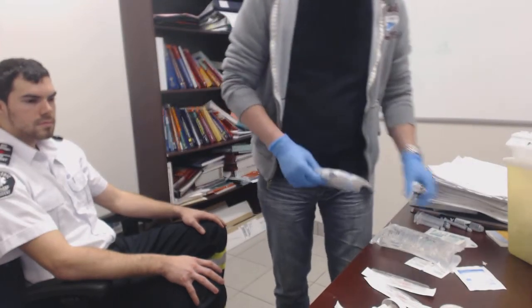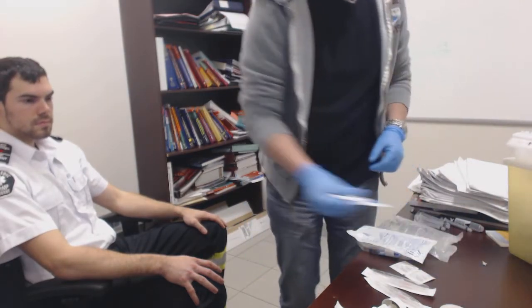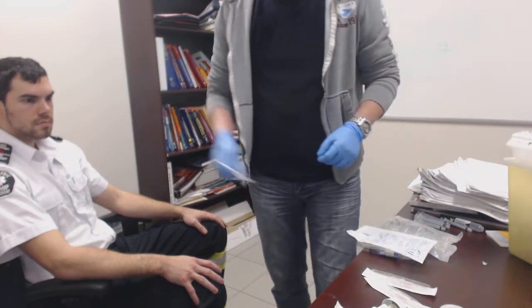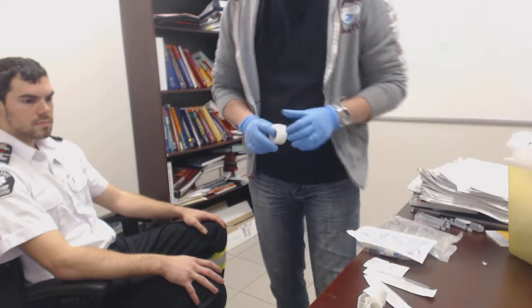We have our drip set. We have our Tegaderm used to secure. We have 2x2 in case there's any blood leaking. Alcohol wipe, tape, tourniquet, and finally the IV Cathlon.